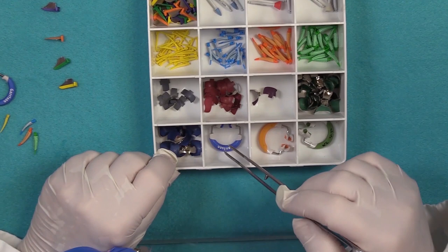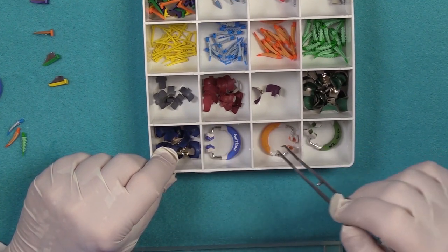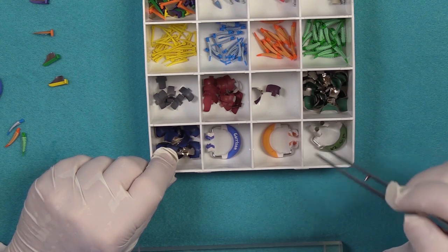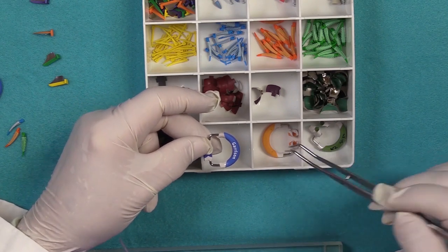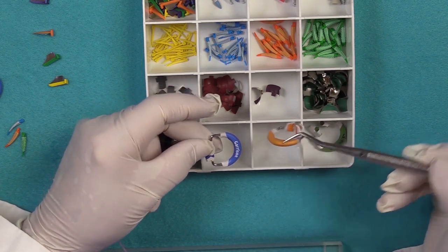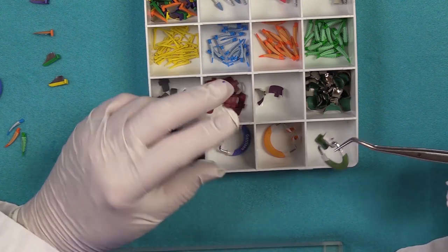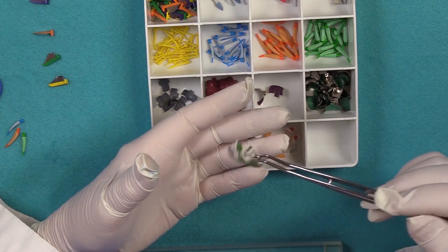And then you have the rings. These 3D rings are available in a standard size and a taller size. This particular one is utilized when you have a broader restoration to place.